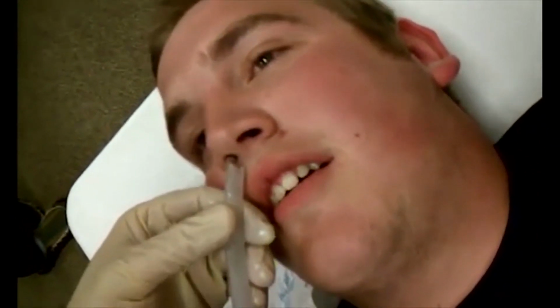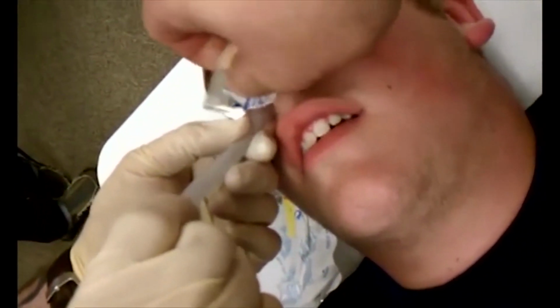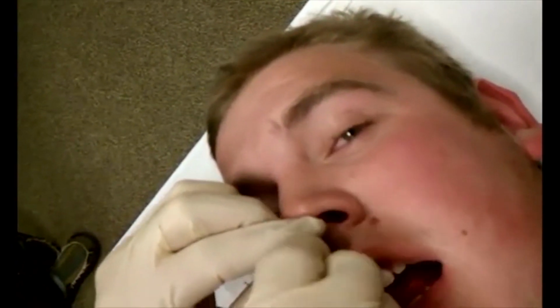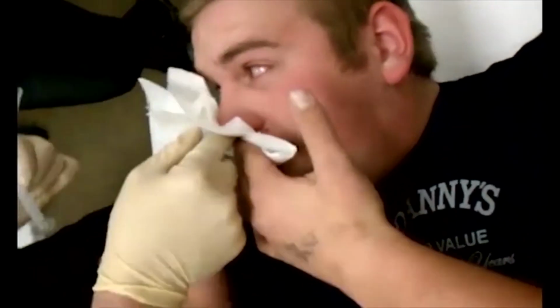And swallow. Okay, so stick it in there just a little bit, then bring it up. There you go. Like this? Yep. I have to put a little more lube on there. Swallow. Keep pushing. Keep pushing. The faster you go, the better it is. Did you hear that? There we go. Go ahead and pull it out. That's the same one that was in her nose.